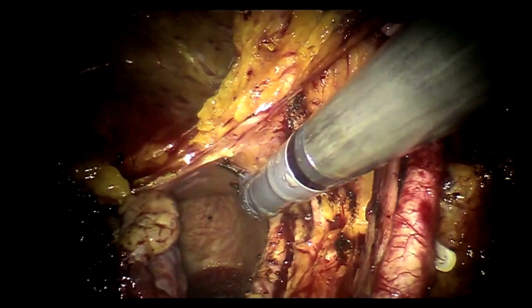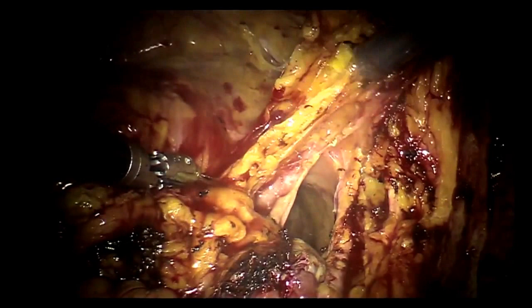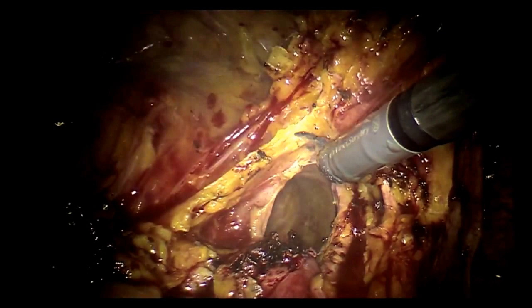Dr. Gill, they say if you do robotic kidney transplantation, you have to be very careful while benching the kidney, because if you have bleeding after revascularization, that might be troublesome for the robotic surgeon. Very good point. Do you agree with that? Very good point.